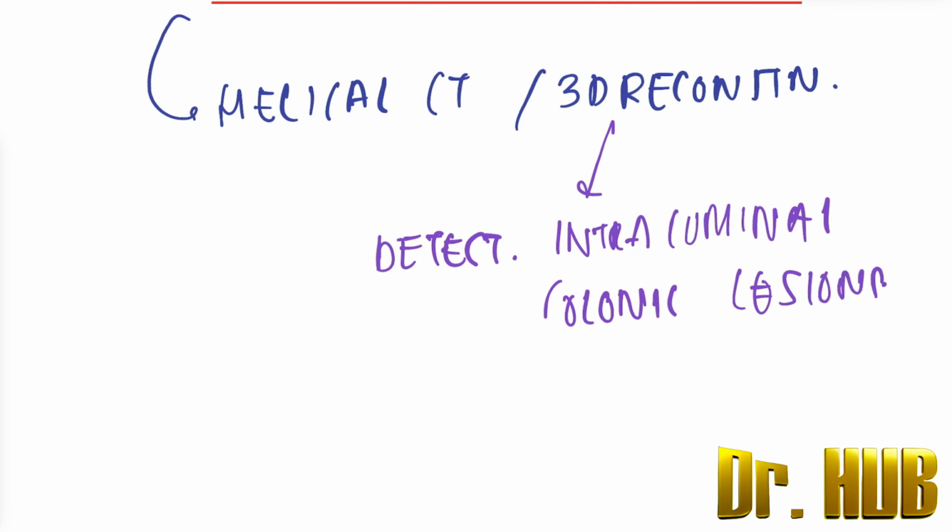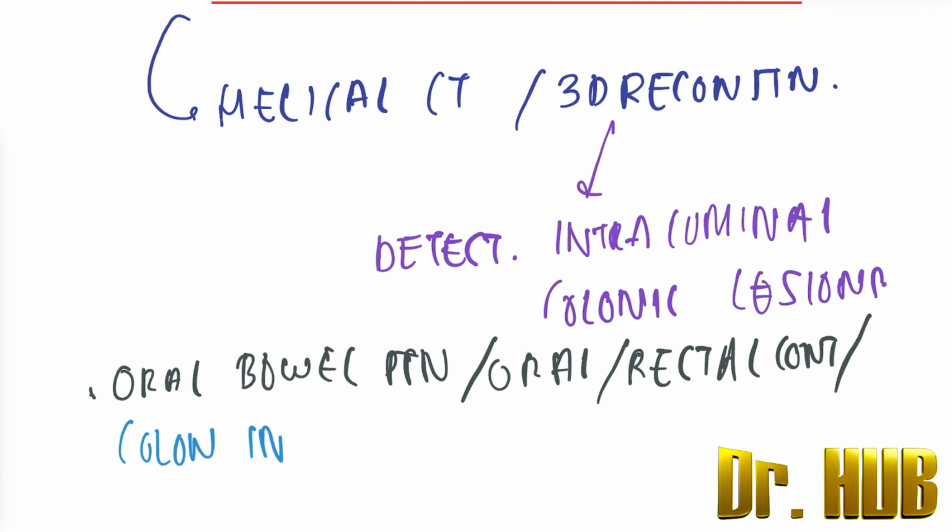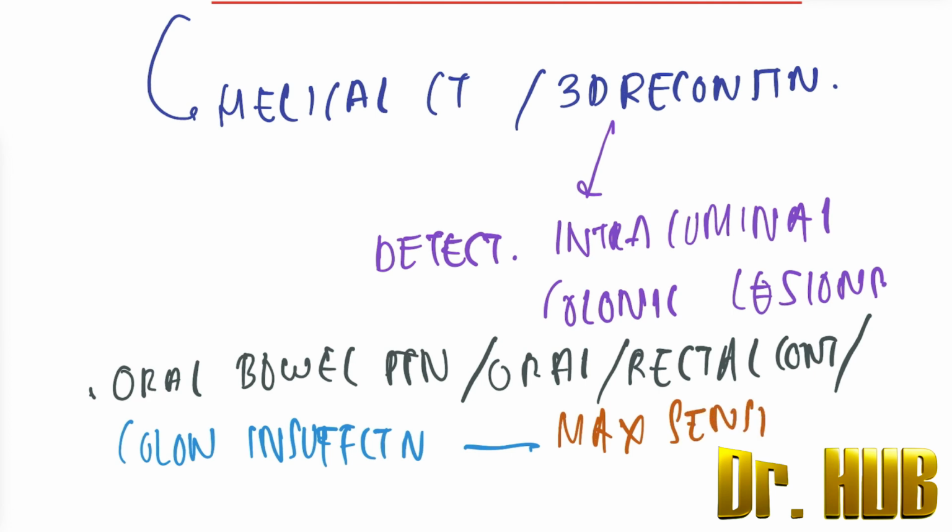So there is oral bowel preparation, there is oral and rectal contrast, and also the colon insufflation. This has to be used for the maximum sensitivity.